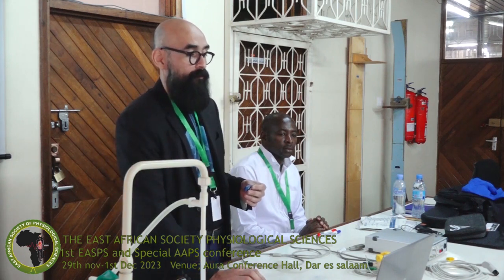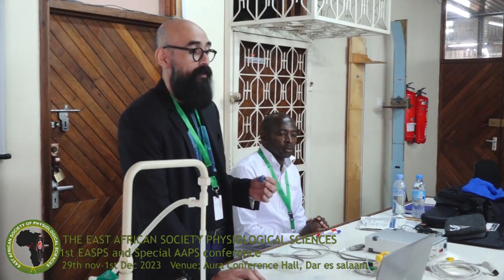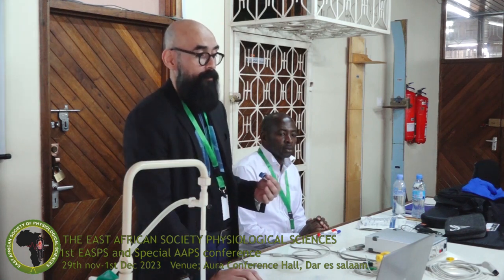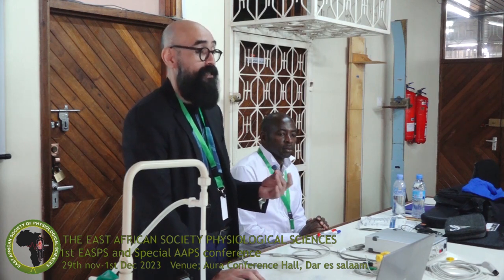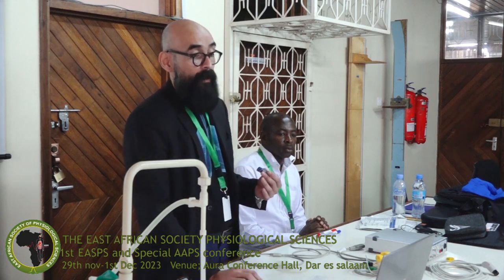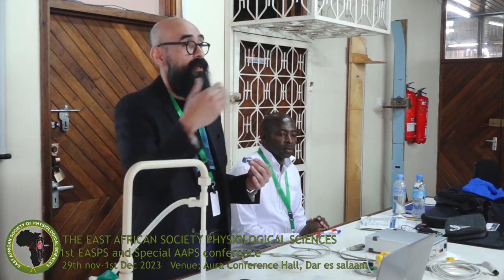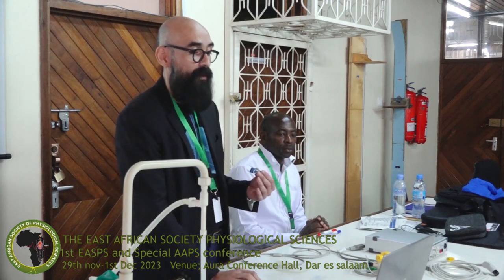So if they say, well, it's about the same size as an EMG signal, they can check the answer right away, and the system will let them know, no, that's not correct, and why? Try it again, right? So they say, okay, let me think about it, it should be less because it's inside the head, and then, right, that's why. And the idea, again, is that they will create this kind of interactive environment in terms of questions and answers for them to start that engagement with the setup.